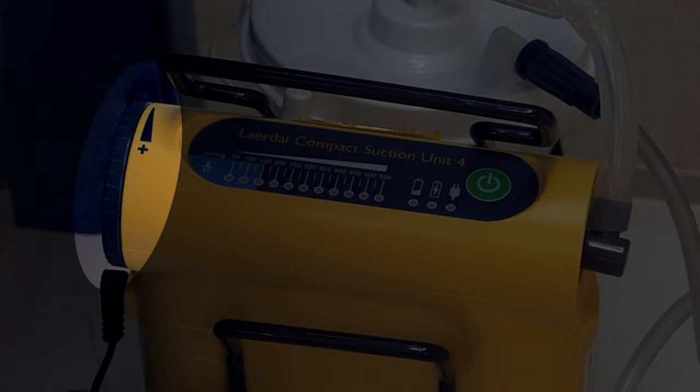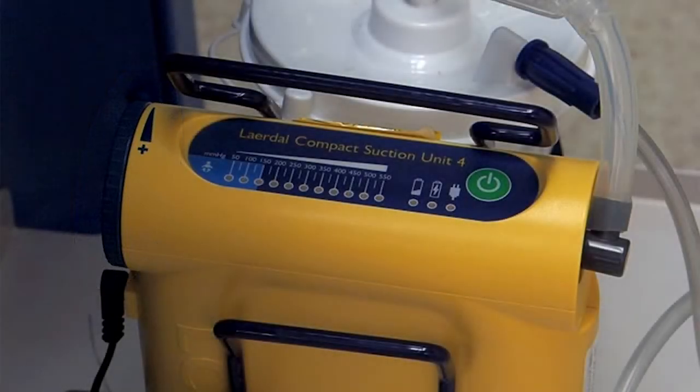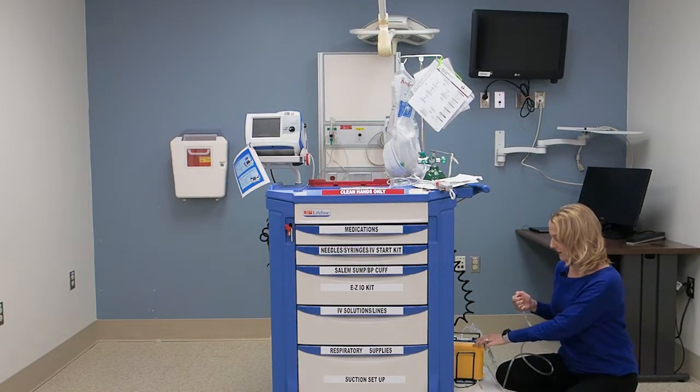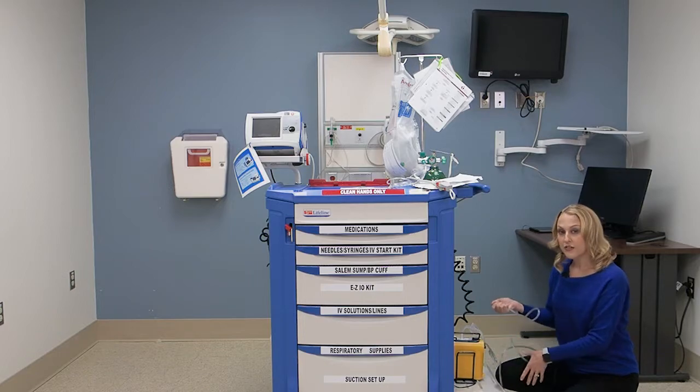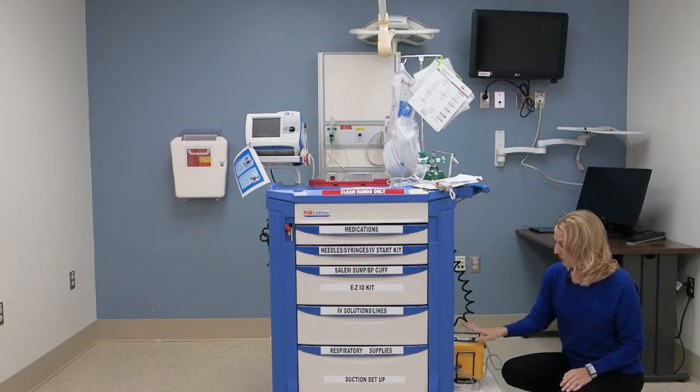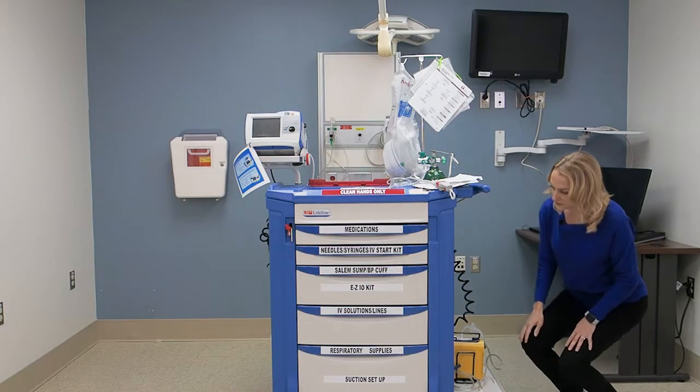If you want to increase the pressure, you just simply dial it towards the plus to increase the pressure, dial it down to decrease the pressure. And if it's working properly, you'll turn it on, and of course you would hear the loud noise that goes when you turn a suction machine on.